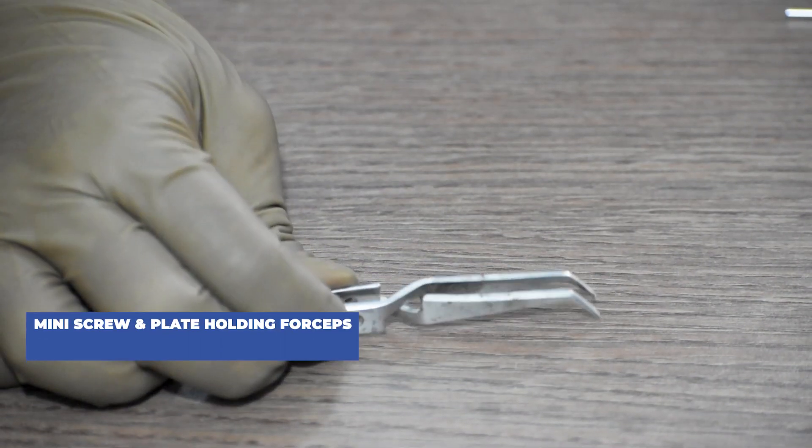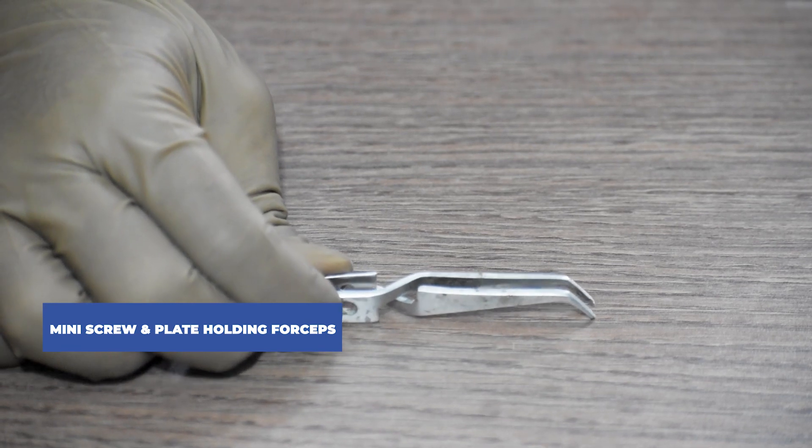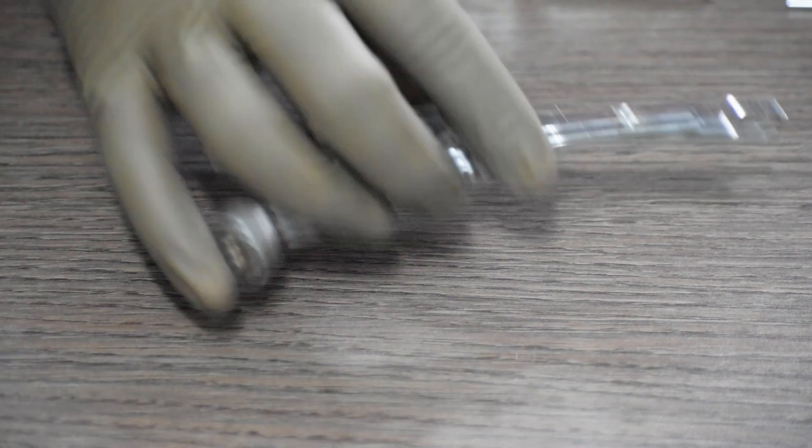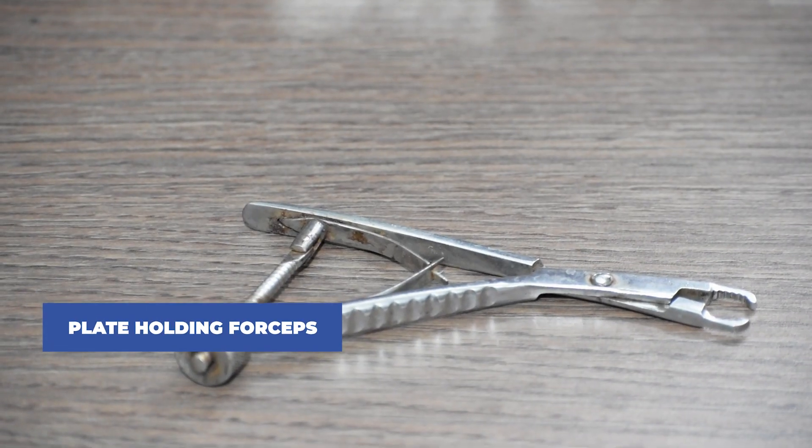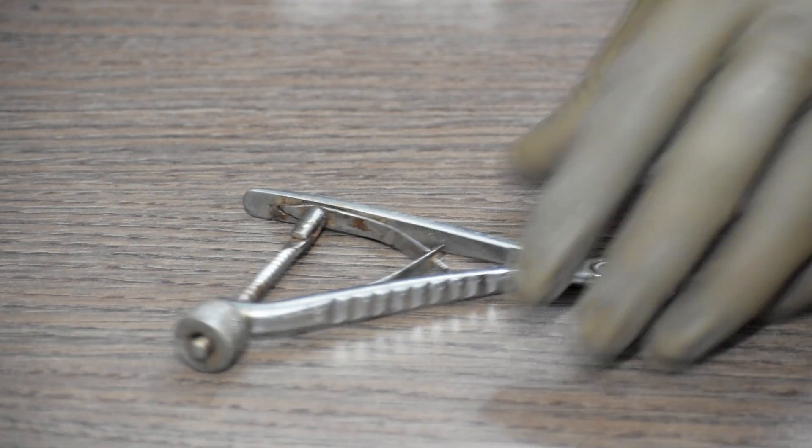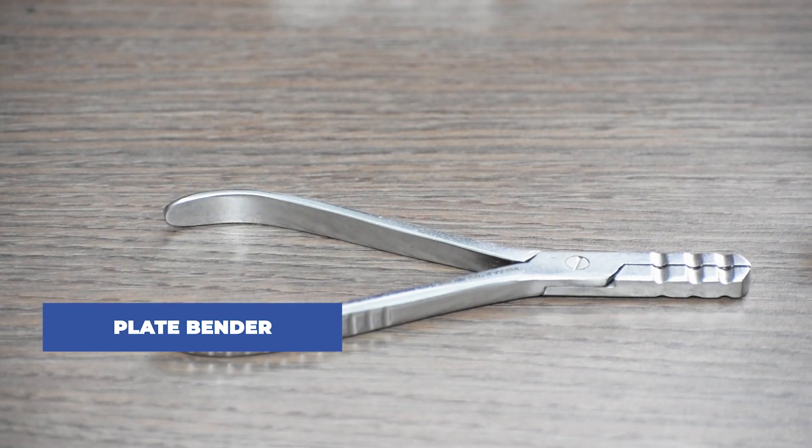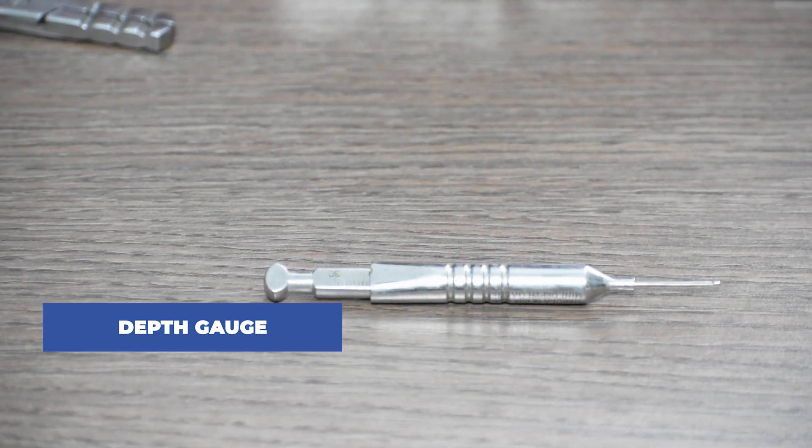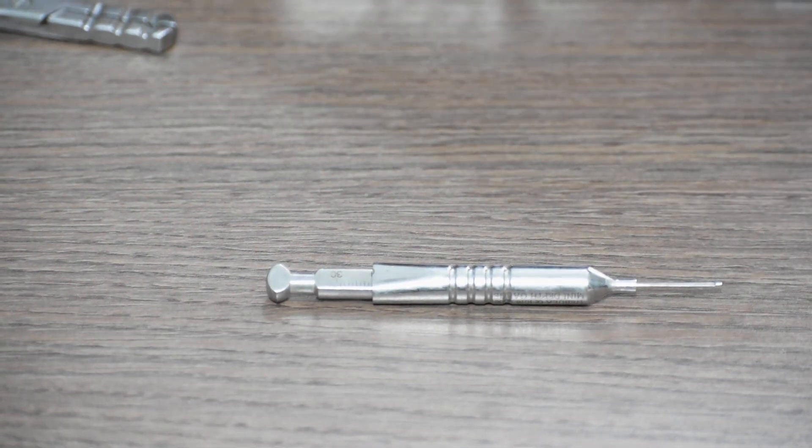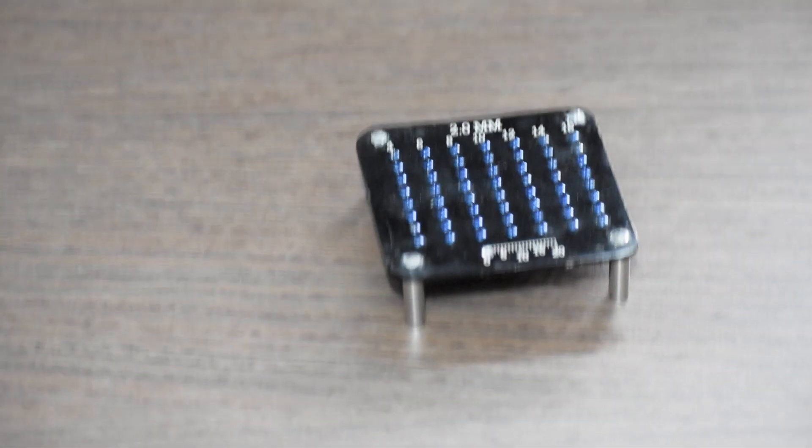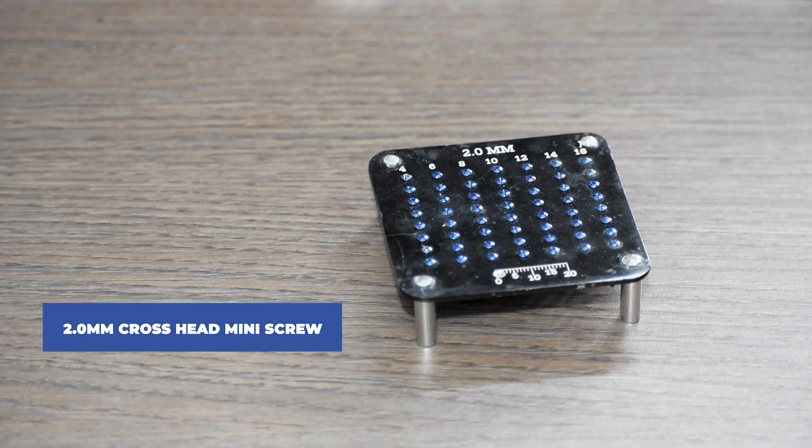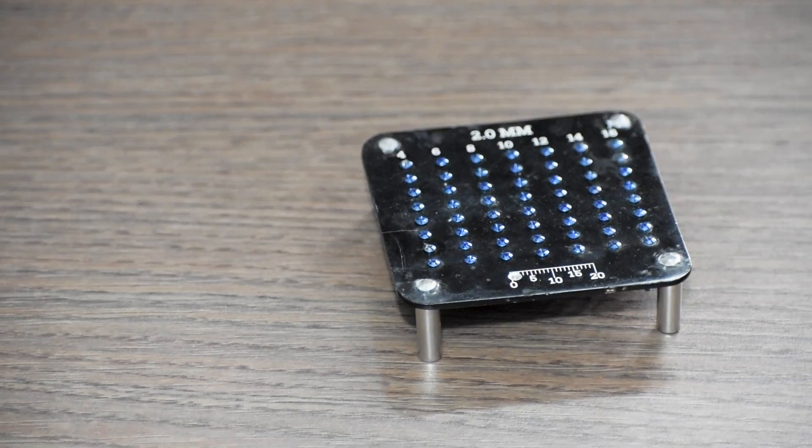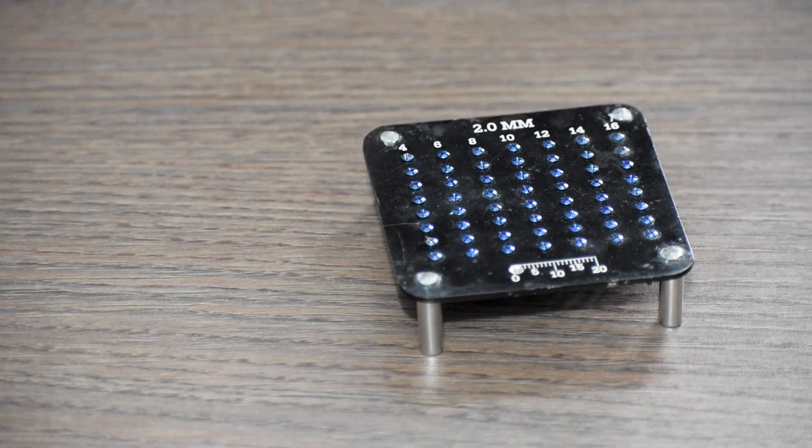Then we will require mini screw and plate holding forceps, then plate holding forceps, plate bender, and depth gauge. We will also require 2mm cross head mini screws from 4mm in length to 16mm in length.